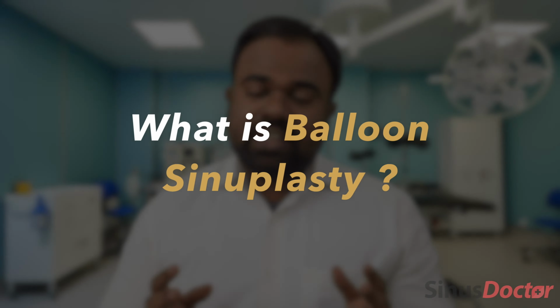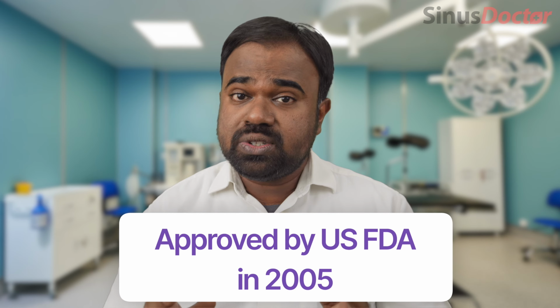So what is balloon sinuplasty? Balloon sinuplasty, I can say, is a game changer in sinus surgery. Balloon sinuplasty was approved by the US FDA in the year 2005 to be used in nose and sinus surgeries. Balloon sinuplasty, unlike traditional sinus surgery, does not involve any cutting. There is no need for removal of bone or soft tissue in balloon sinuplasty. A small flexible balloon is passed through the blocked sinus drainage pathways, and these blocked sinus drainage pathways are opened and the sinus drainage mechanisms are restored. Let me show you how.